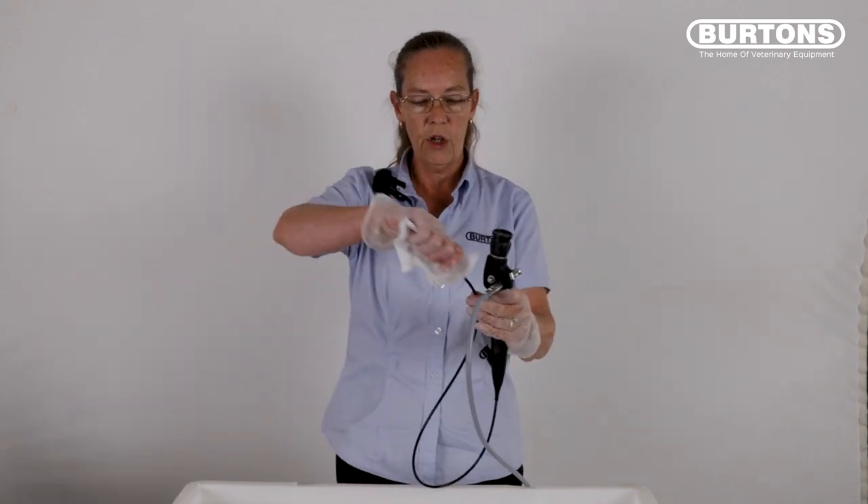The following video has been designed to help you clean and disinfect your Burton's bronchoscope. At the end of the clinical procedure, remove the gross contamination from the patient tube.